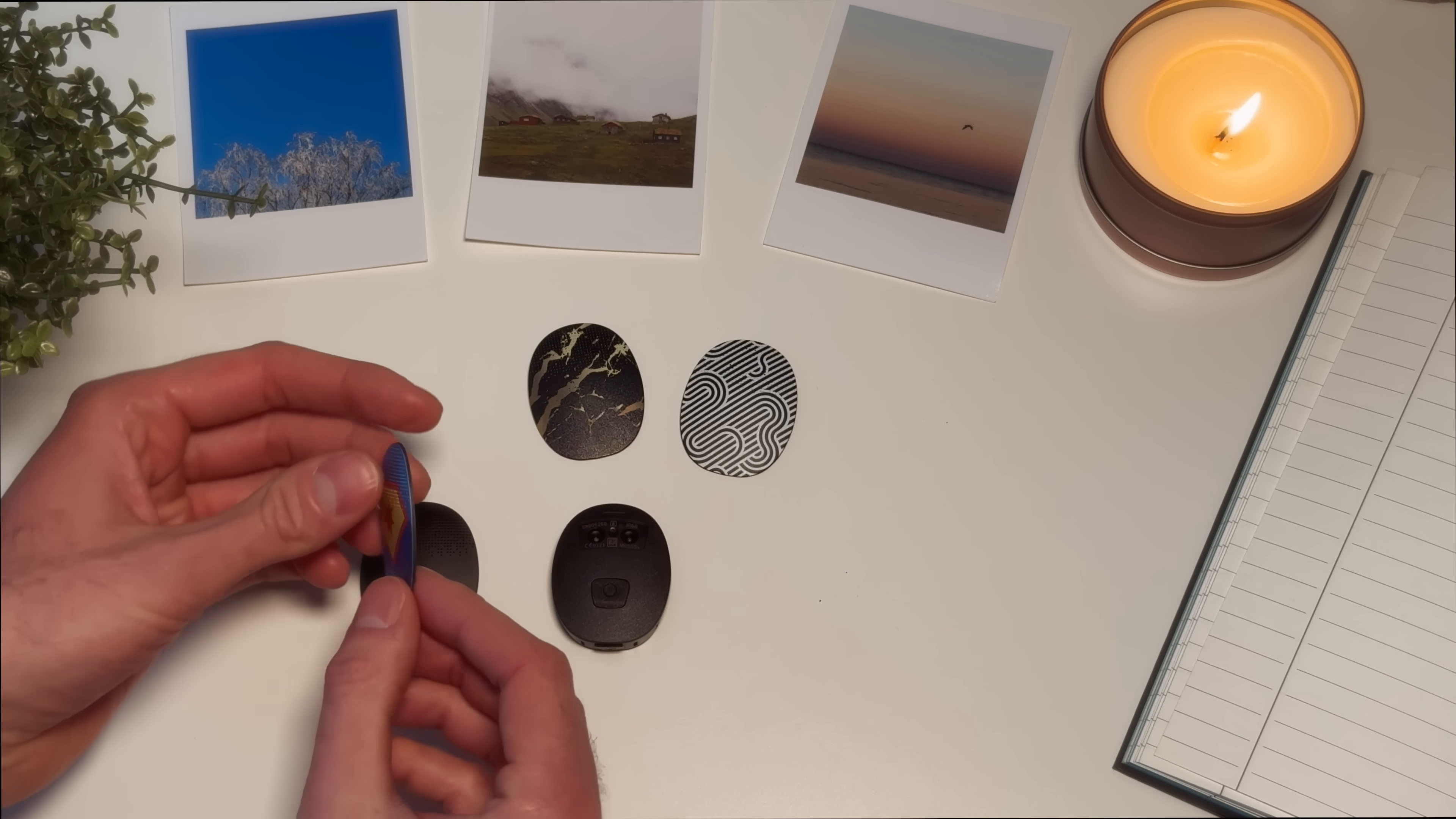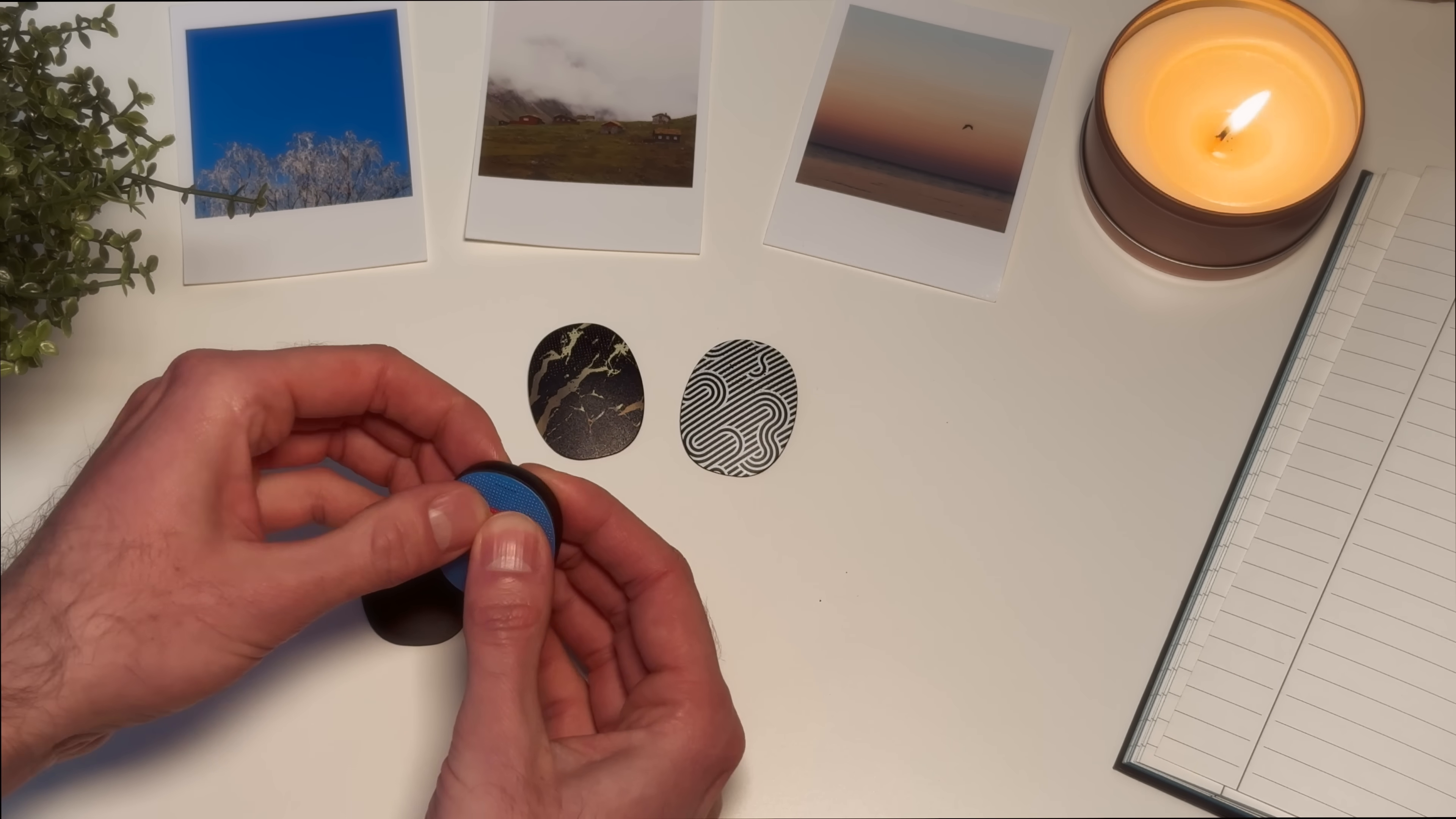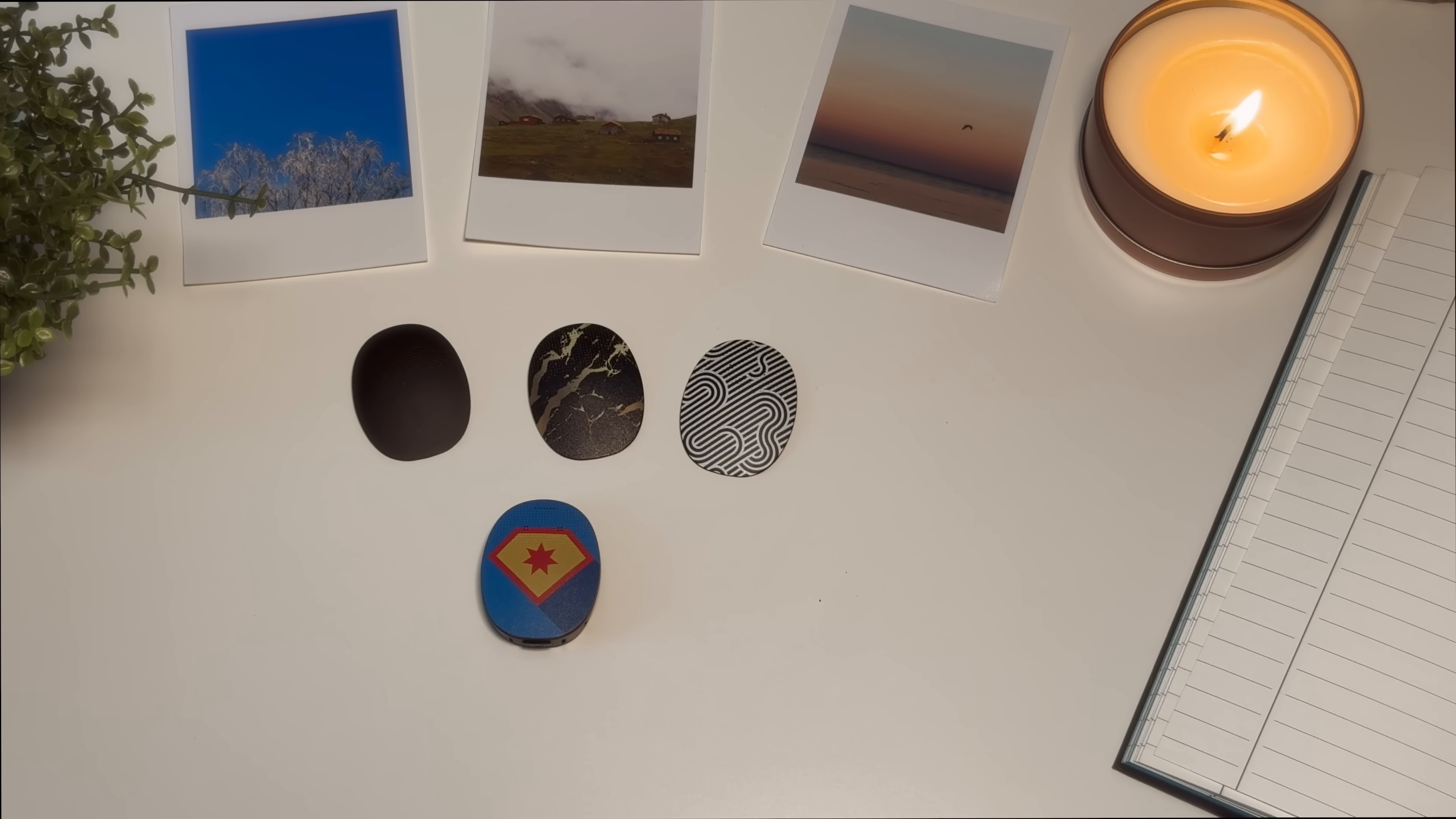Hold the new cover over the microphone openings of the processor and push down until it snaps into place. Then gently press down on the edges of the cover to ensure it has snapped into place. You just need to repeat the process to change your style. It's very easy.